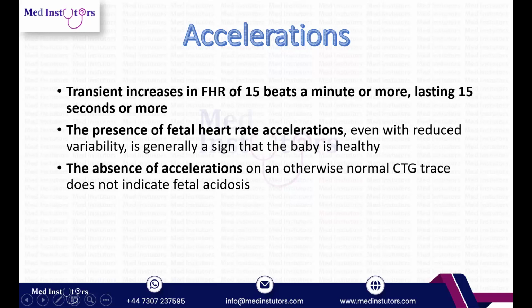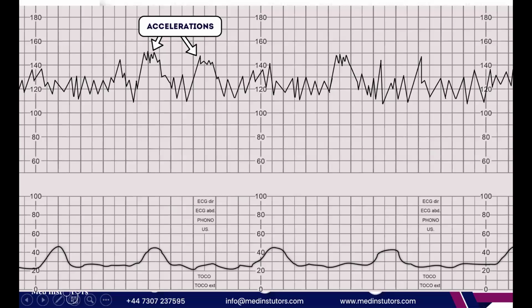However, the absence of accelerations in an otherwise normal CTG doesn't mean that the baby has fetal acidosis. That means that if the CTG is otherwise good and there is no acceleration, the baby could be in a sleeping time or a quiescence period. So we would maybe want to repeat it after some time, but that doesn't mean that it's suspicious. That means it's not an amber feature, correct? Otherwise normal CTG, absence of accelerations, it's fine. These are classic accelerations, as you can see here.